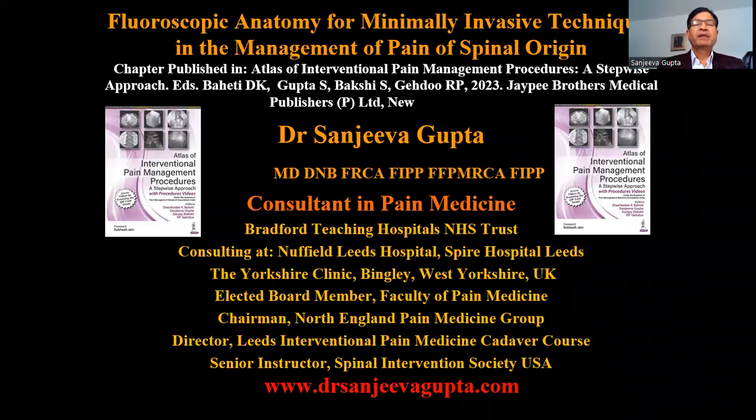Welcome to you all. I'll be discussing the fluoroscopic anatomy for minimally invasive techniques in the management of pain of spinal origin. In the first part, I discussed the fluoroscopic anatomy of the lumbosacral spine. In the second part, which I'm going to record now, I'll be discussing the fluoroscopic anatomy for minimally invasive techniques to manage pain that originates from the cervical and thoracic spine.